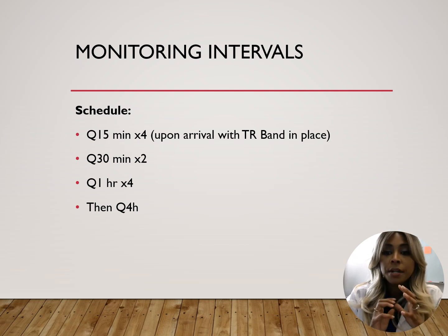And of course, don't forget to do your orthostatic vitals in addition to these after the band has been removed. So once the band has been removed, all the air is out, you're going to do your orthostatics, and then we go from there.